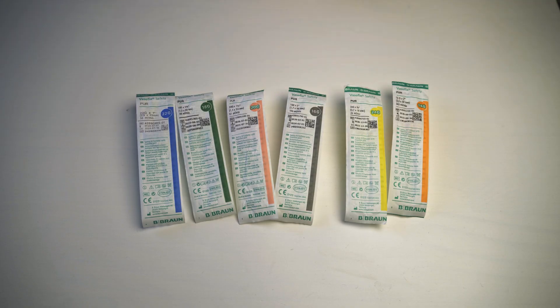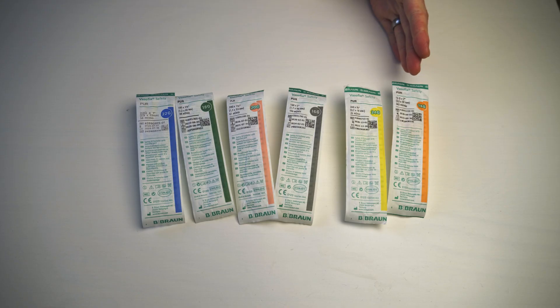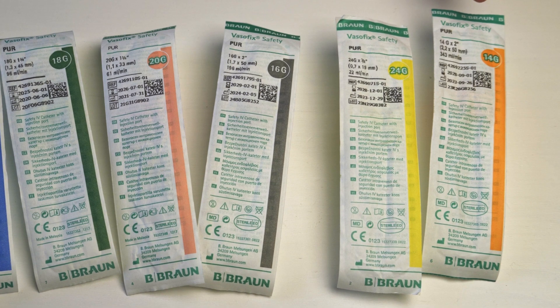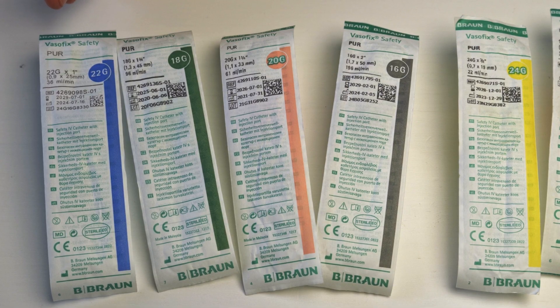These IV cannulas are measured in a gauge. The smaller the number, the bigger the needle. So the biggest that you'll probably see on an ambulance is a 14 gauge. You do get bigger than that, but that is the biggest needle that we carry. And the 22 gauge is the smallest needle that we carry.